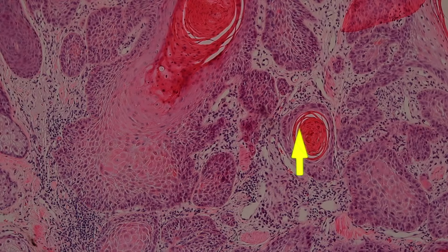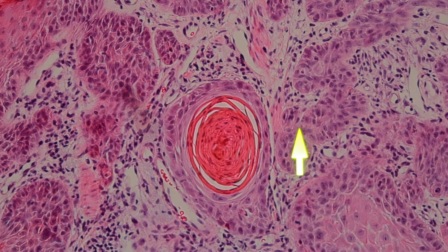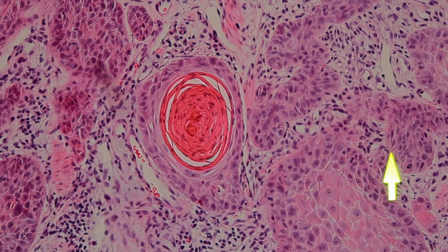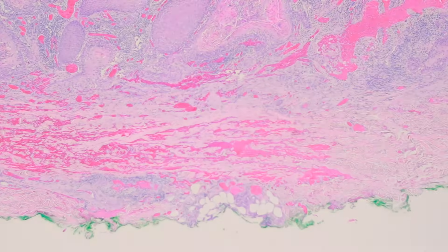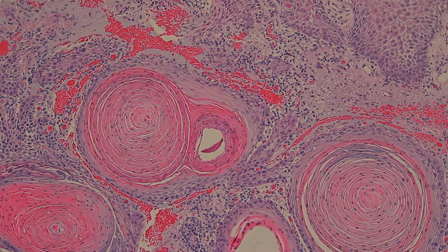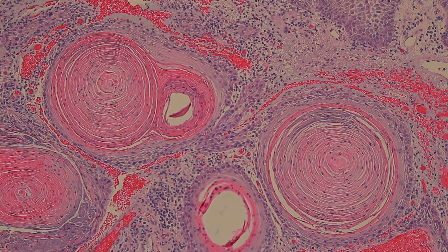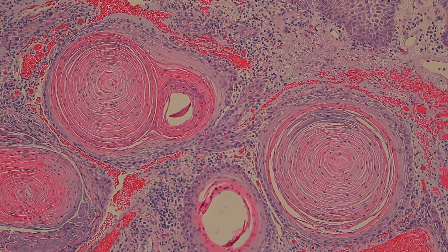Here we go — more keratin pearls right there. Parakeratosis, dense and swirly, with atypical keratinocytes adjacent to it. There's another one right there. And then one last example — this one just because the keratin pearls are so very, very swirly and big. Look at that — it's like a spiral. It's amazing.